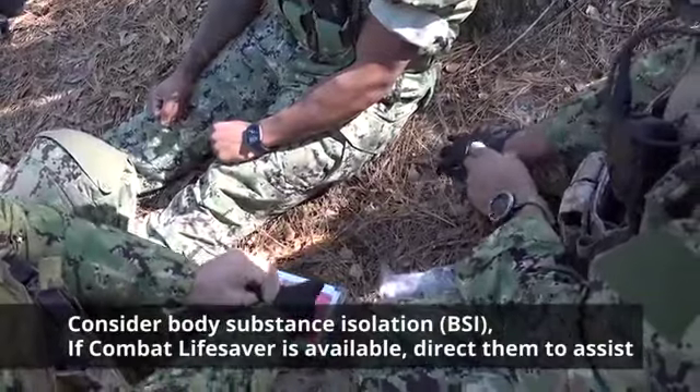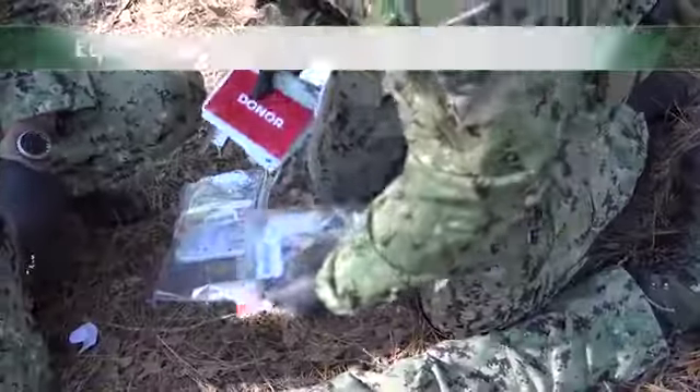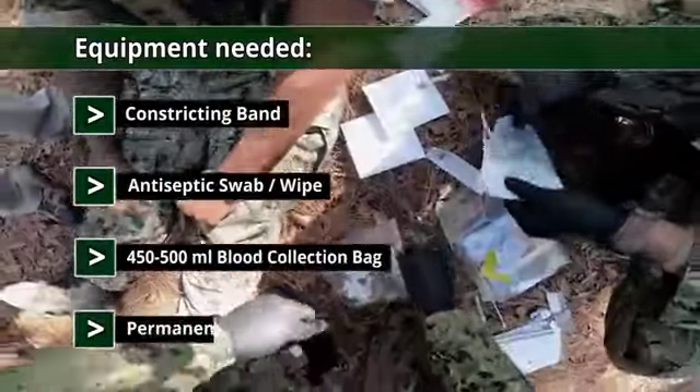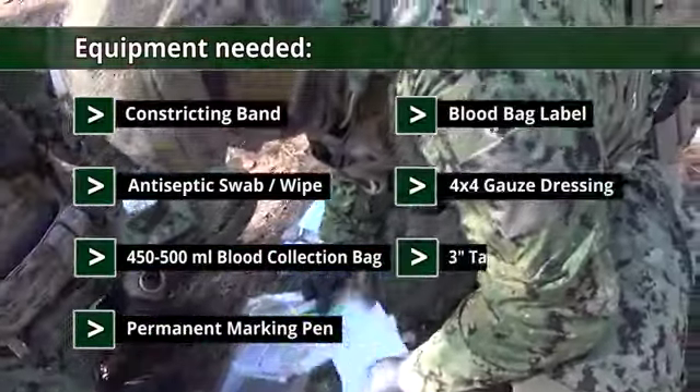Consider body substance isolation. If a combat lifesaver is available, direct them to assist. Gather the equipment needed: a constricting band, antiseptic swab or wipe, 450 to 500 milliliter blood collection bag, permanent marking pen, blood bag label, 4x4 gauze dressing, and 3 inch tape.